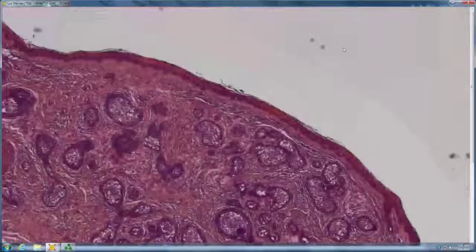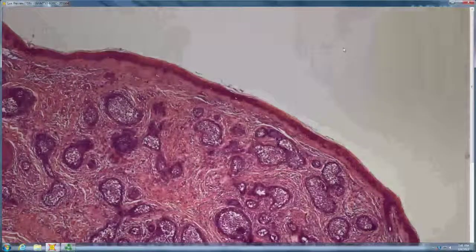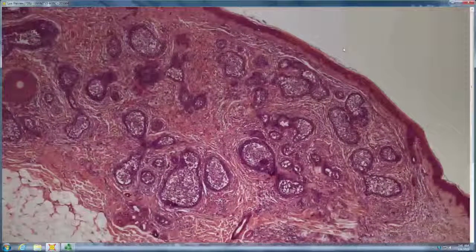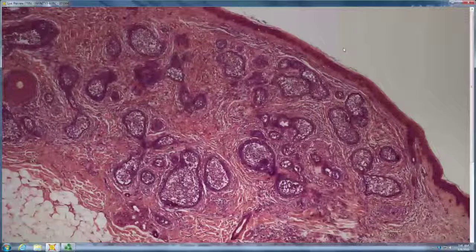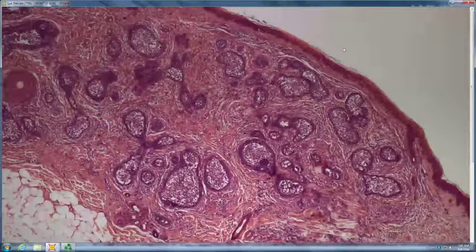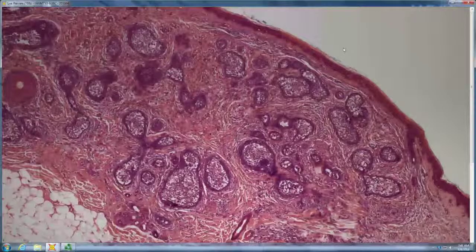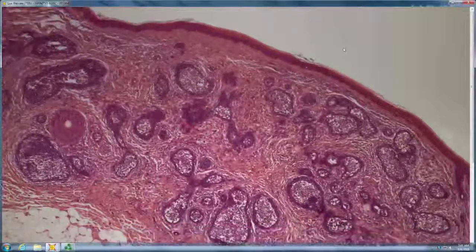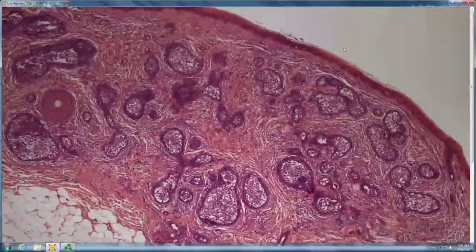Okay, David, are you passing or playing? I'll play. It looks like it has that pilar look, that concentric fibroblast-rich stroma with basaloid palisading, and in the middle there are probably lymphocytes. Probably lymphs and histiocytes. So like a lymphadenoma. So this is cutaneous lymphadenoma.